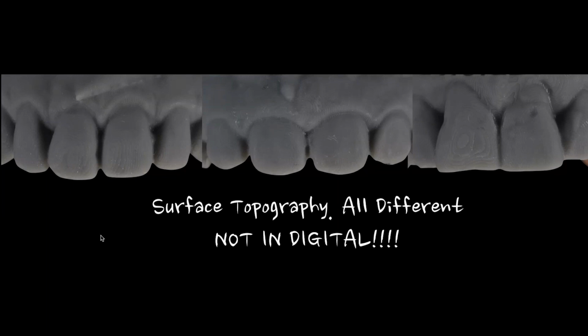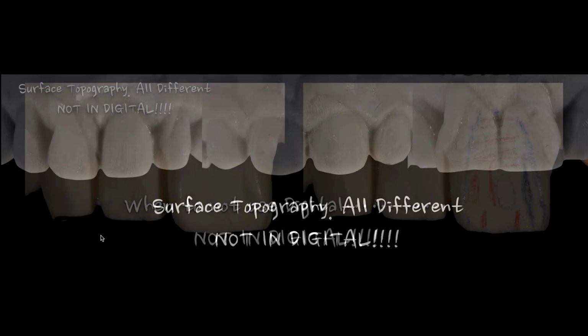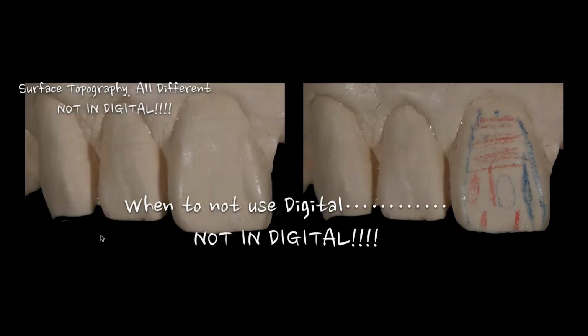So for me, I'm not a fan of digital when it comes to really nailing certain things. Does that mean that I don't use digital models? Of course not. We use lots of them. I have 3 printers, and we're always printing, and a lot of my doctors have printers today. But in the end, what I want to be clear about is that you can't really see surface topography in a digital cast. So let's just accept that and understand that there might be times when we shouldn't be doing digital.